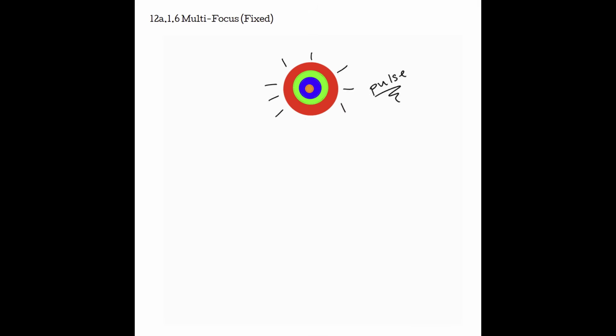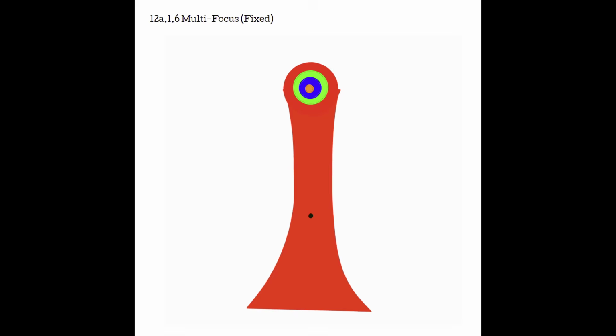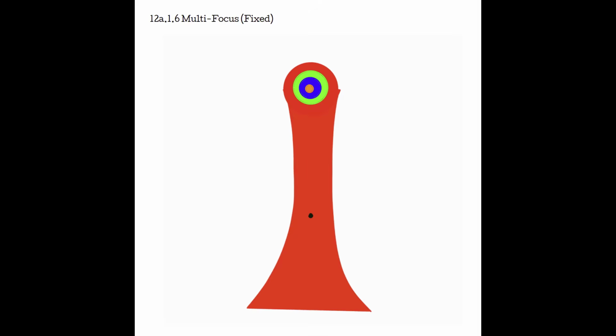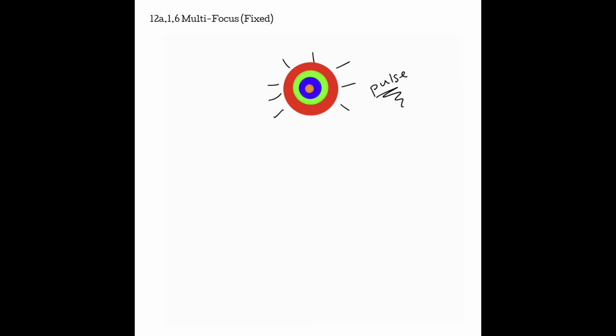In this type of array transducer, you will see that there are elements that are circular shaped, aligned as concentric rings at the face of the transducer. It looks kind of like a singular element transducer. However, each ring is going to act individually as its own element. By introducing the different rings, we are creating crystals that have different diameters.